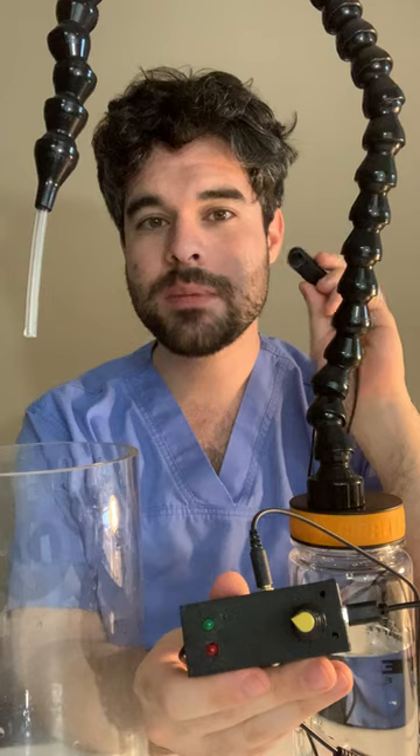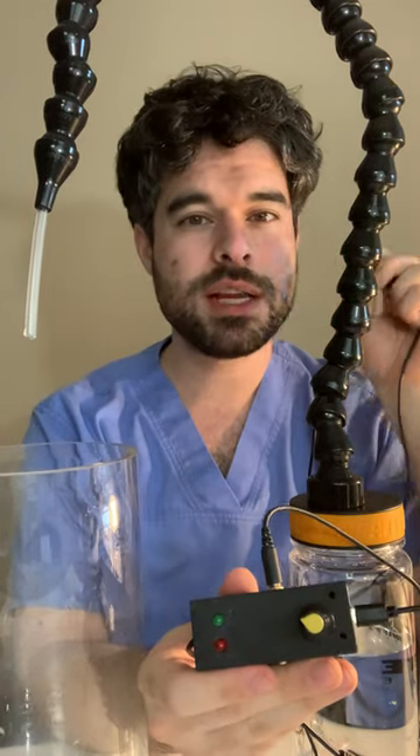You can see over here when I push this switch, if I want I can just get one tiny little drop at a time coming out — a very small amount.